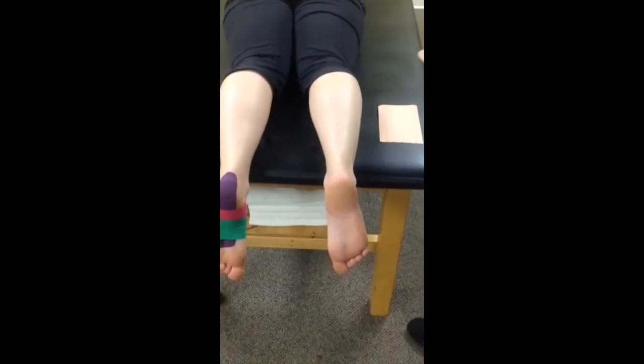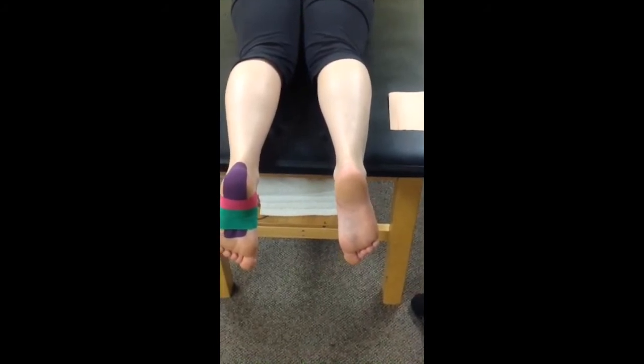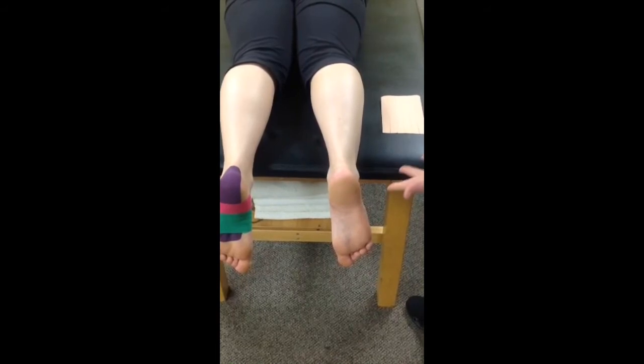I've actually walked you through a couple of different taping techniques. So now we're going to do a technique for any kind of swelling. Now if you have a significant amount of swelling where you need this technique, you probably shouldn't be running anyways.